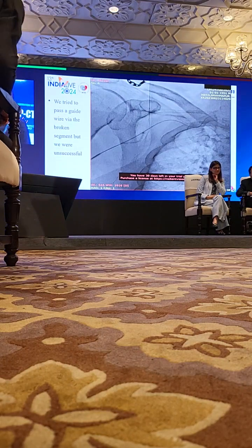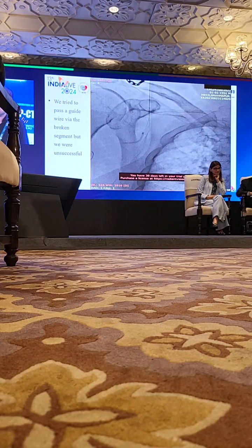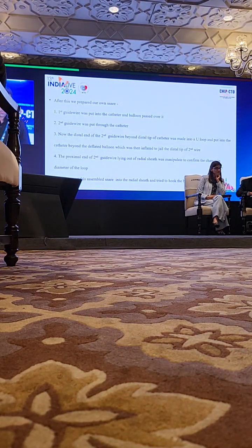Then we gathered courage and tried to pass the guide wire via the broken catheter, thinking that if we are successful, then we'll inflate the balloon and pull it back. It would become simple. But we were not successful. After this, we prepared our own snare. Unluckily, that day in our cath lab, the snare catheter was out of stock. Then we prepared our own snare.